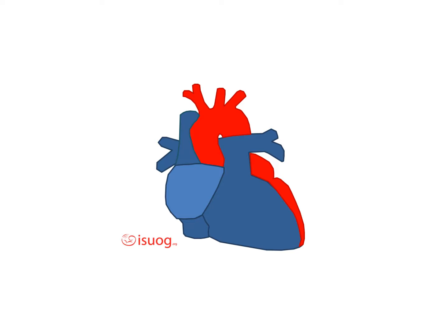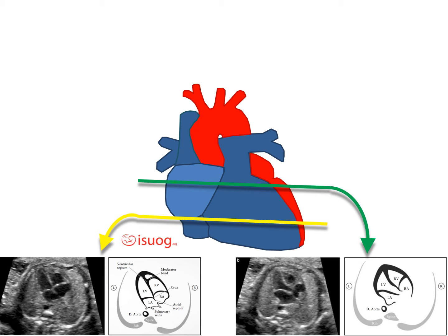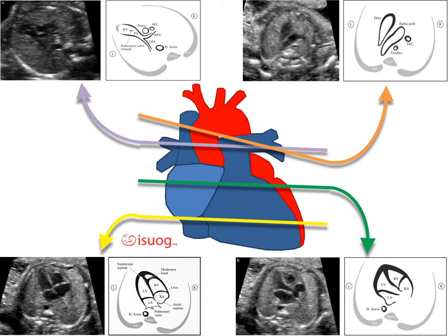Some important points as you scan up above the diaphragm into the heart in a transverse view: you can see how each level of sweeping upward — from the diaphragm, up into the four-chamber view, just above at the outflow tracts, and even more cephalad to the three-vessel view — followed by a slight clockwise rotation to show the V of the aortic and ductal arches. These are at different levels in the fetal thorax, and rather than just tipping the probe cephalad, you want to make these slight sweeps, sliding the transducer toward the upper part of the chest to get these different views.